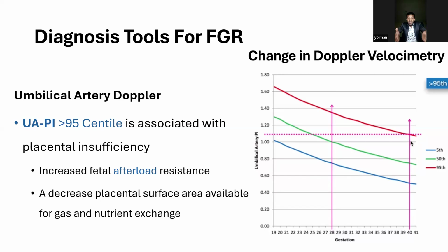After you obtain those arteries, there is still work to do, and that is plotting a graph again. So that is boring. You may call it boring, but the most important thing is that it is associated with severe neurological and metabolic disturbance for the fetus, and it may result in stillbirth. With that being said, to decrease the workload, I will provide you a very good trick.